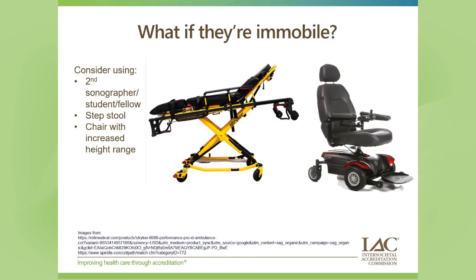Using a step stool, do you have something that can bring you up higher so that you're able to do this from that additional height perspective? And then that chair with increased height range is also important. So pulling in something like that, asking the patient, how far back does this chair go? Are you able to get into more of a supine position in this? Most of them will be able to tell you whether they're able to go back far enough.